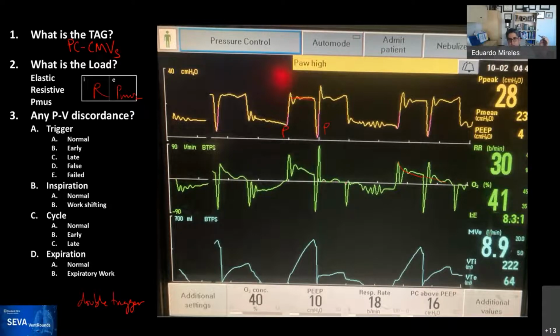And look at the flow. It goes really down, up. You see this little thing. And then there's barely any air out. And then there's this. And then the patient tries to do exhalation. Is this a patient-triggered breath here? It is. You see actually the pressure drop a little bit.